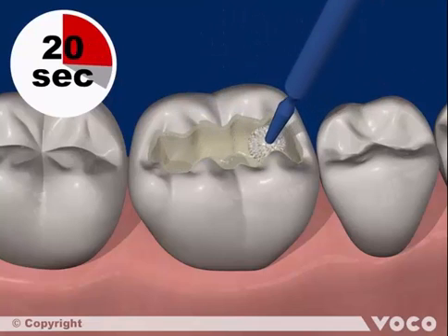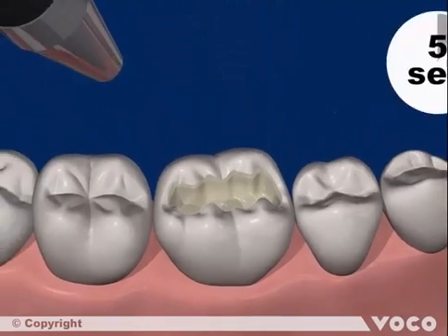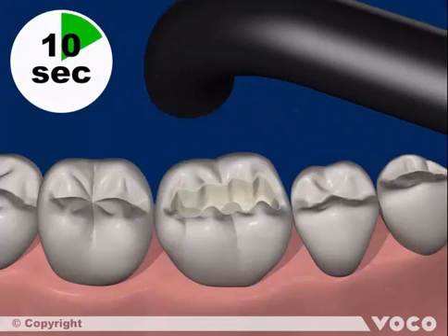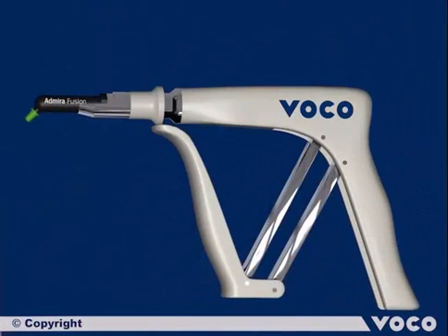The adhesive is applied for 20 seconds, then dried off with dry oil-free air for at least five to ten seconds. Ten seconds of light polymerization is necessary to cure the layer completely.